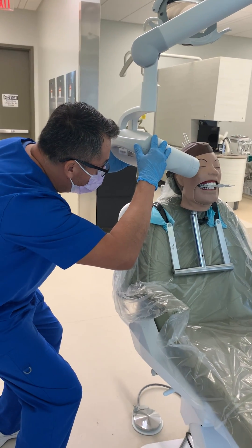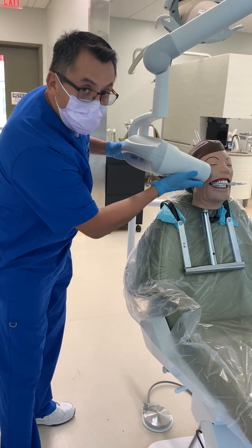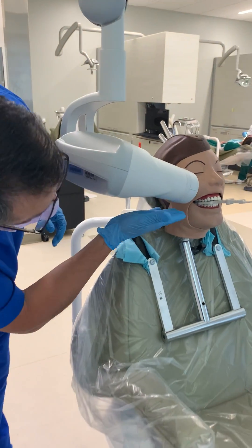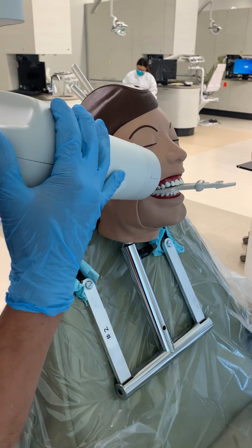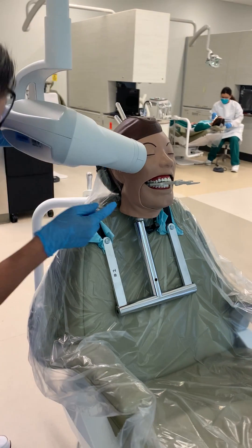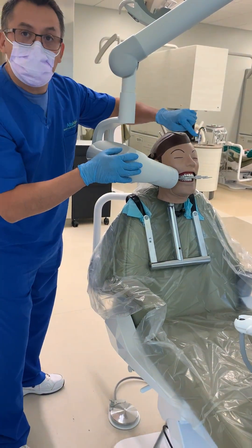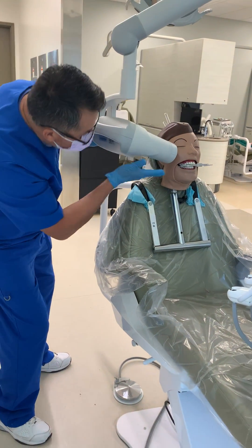There are two things you have to consider. As reference, make sure you align the bottom part of the PID with the snap rate. If it's too high, you're going to get a cone cut. If it's too low, you're going to cone cut the upper portion of the film. So make sure it's aligned at the bottom.